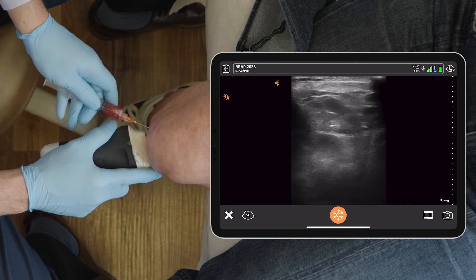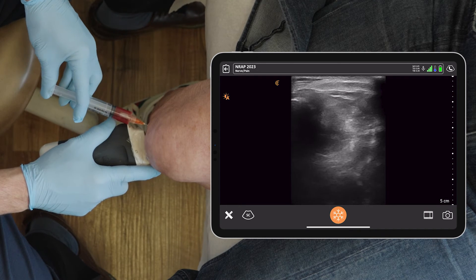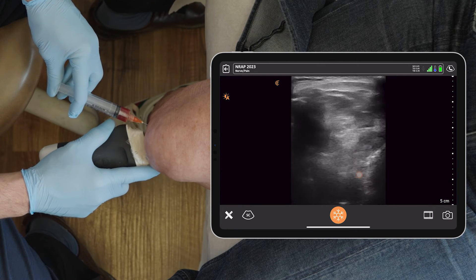Pinch. We're in the joint and we're injecting. You can see on the bottom right corner the medication spreading.